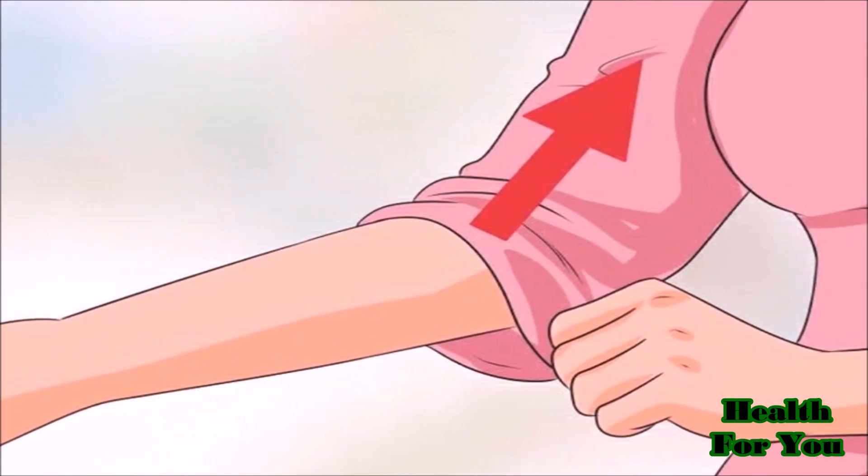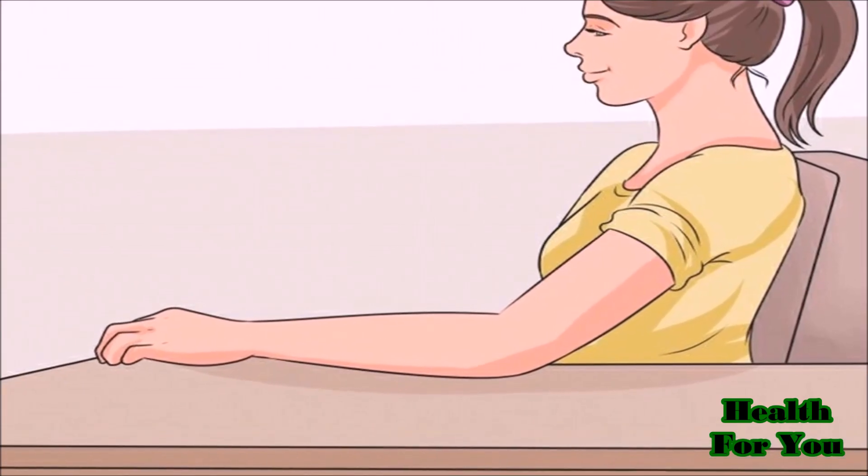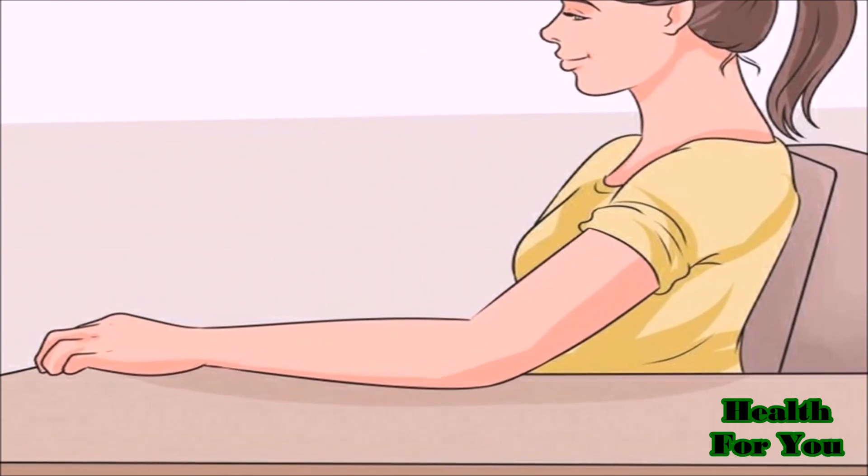Roll up the left sleeve for exposure of the upper arm. Rest the left forearm on the table and position the left arm so that it rests at about heart level.